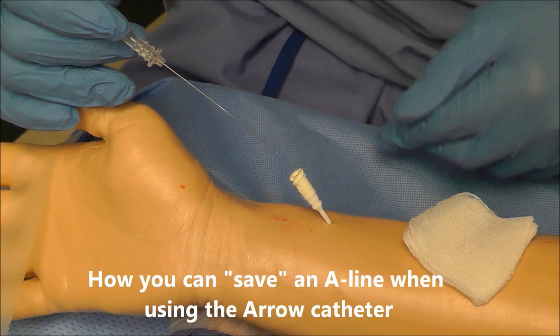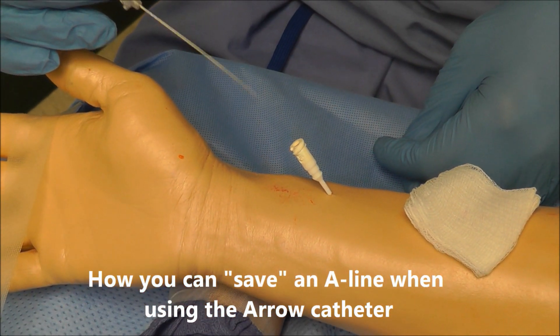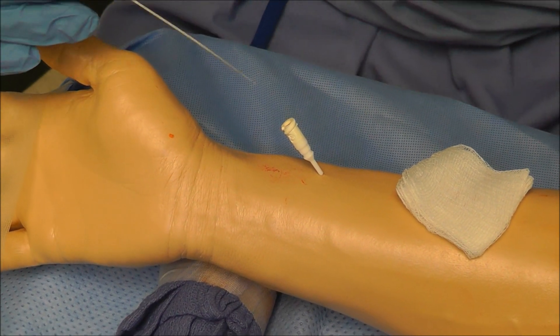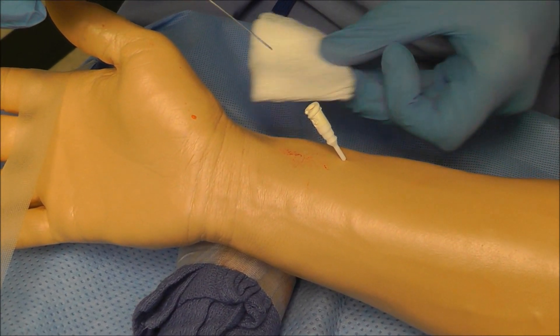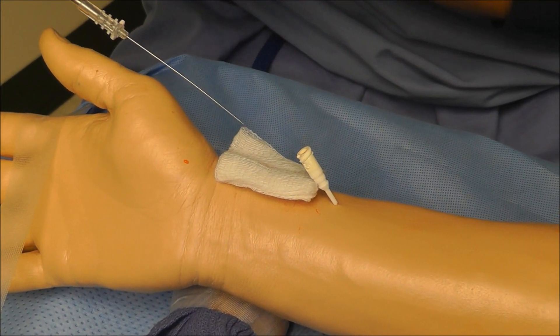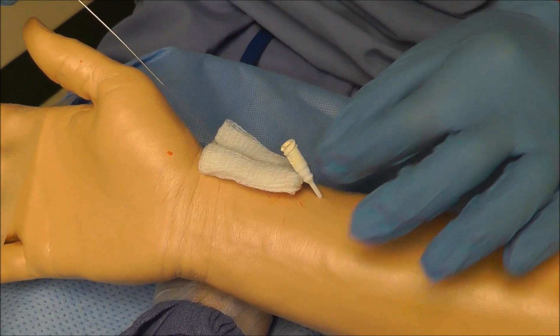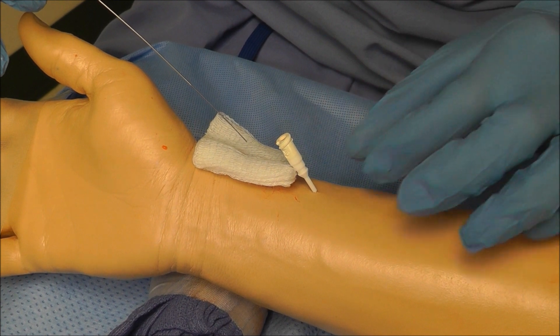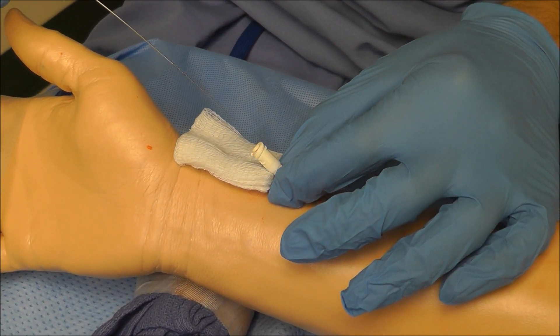Sometimes when doing this type of A-line, you're actually going to insert the catheter too far and go through the other end of the artery and blow the artery. That's not that big of a deal because you can easily save this. The technique is to place gauze here, get our wire ready, advance our wire through that needle, and then pull this catheter back until we see pulsatile blood — then we can advance our wire through the catheter.